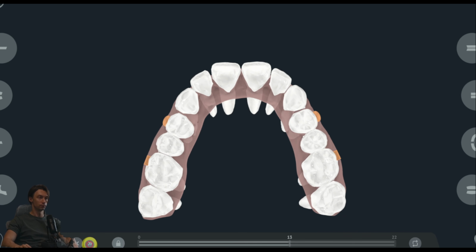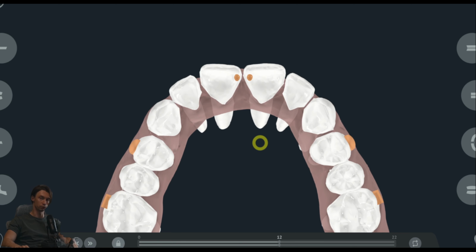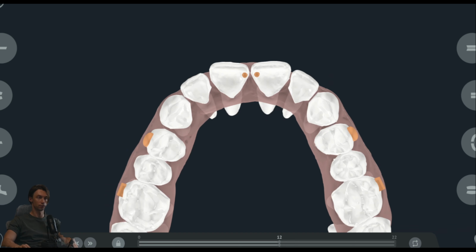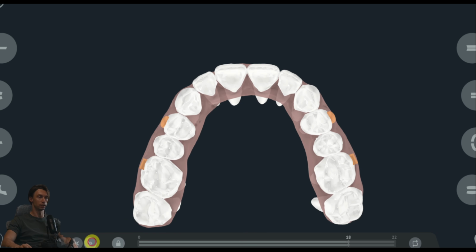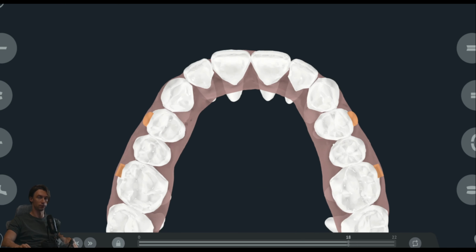We move the teeth into this position, placing incisors and canines with small gaps. At the first layer, we place negative attachments to help with the rotation of these teeth. Then we perform retraction and complete the rotation by moving the negative attachments to the vestibular surface of the teeth. This is our final result with a slight overcorrection.